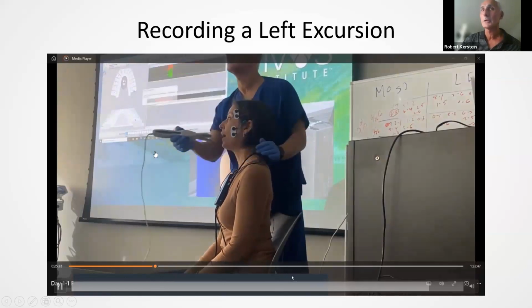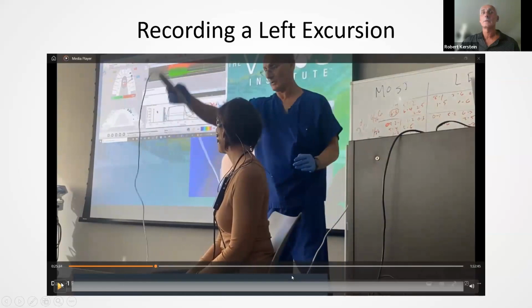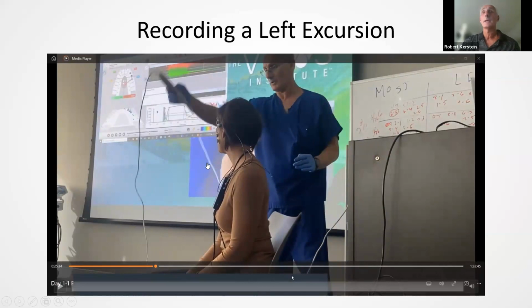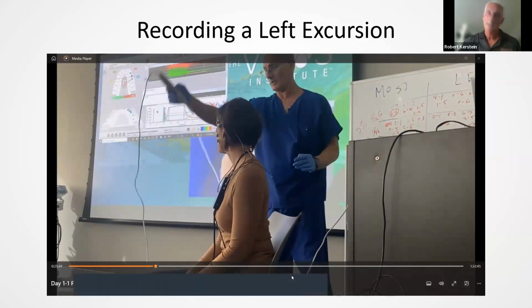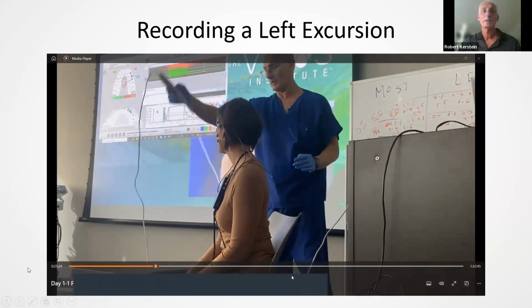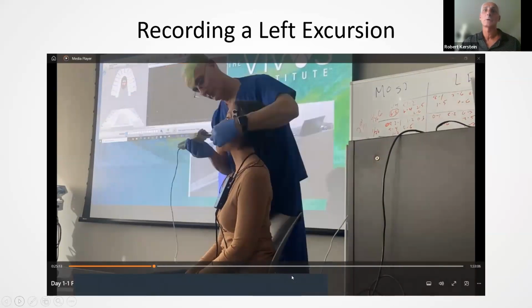It's so critical to watch the screen when you record. Otherwise, you have no idea if the patient did what you wanted them to do. And sometimes they won't do what you want them to do, and you can make mid-recording corrections. You can say, no, Mrs. Smith, bite down much harder, squeeze harder. Then when all the colors come up and you see a few pinks, then you say, now go left. But you can't know those things unless you watch the movie happening in real time. And that's one of the great advantages of the teaching, is real-time recording.